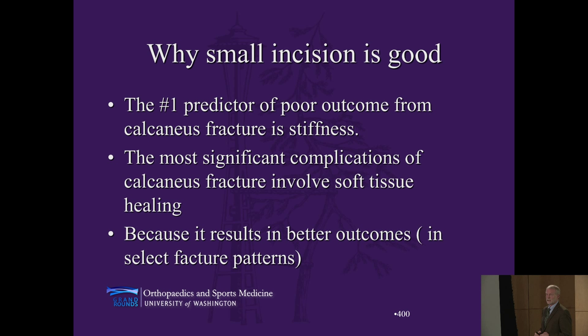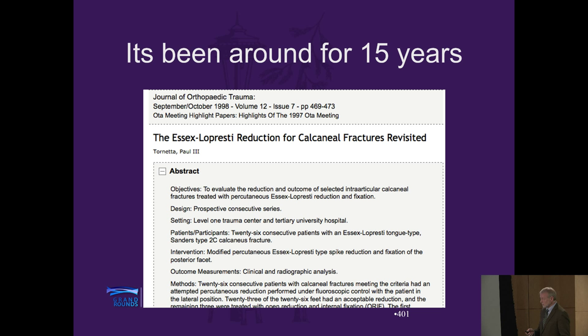The biggest complication from treatment of calcaneus fractures is wound healing complications. And I know that Dr. Benirschke just reported a 1.6% wound healing rate, but that is way different than most of the literature shows. And even in our institution, small incision results in better outcomes. So this concept's been around for 15 years. This is one of Paul Tornetta's papers. I've actually been doing this for about 20 years, and I'll show you that patient here in a moment.